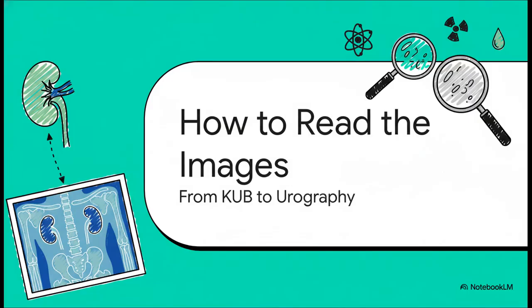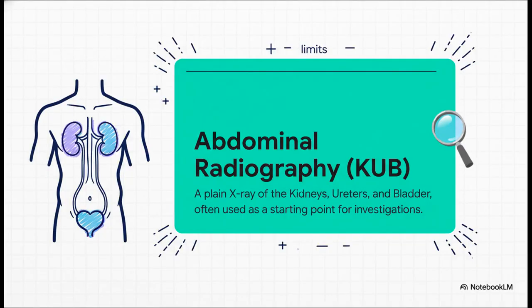Right. We know the tools. So what do the images actually look like? Let's try to see things through a radiologist's eyes, starting with a real classic. This is what's called a KUB. Yep, KUB. It stands for kidneys, ureters, and bladder, and it's basically just a plain old X-ray of your tummy. It's often the very first thing they'll do, a quick and easy starting point that can give some early clues, but, and this is a big but, it's definitely got its limitations.